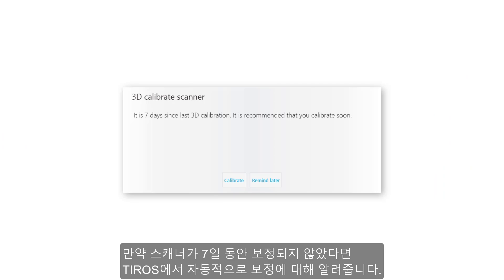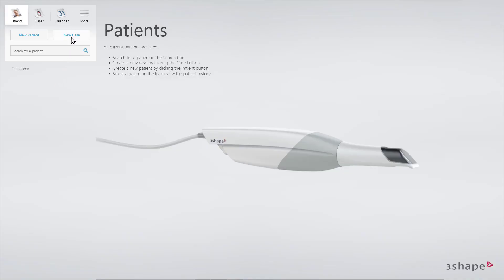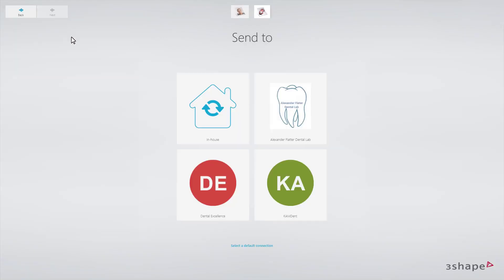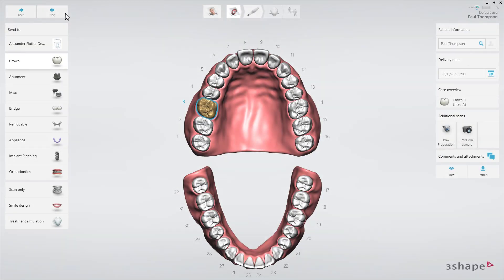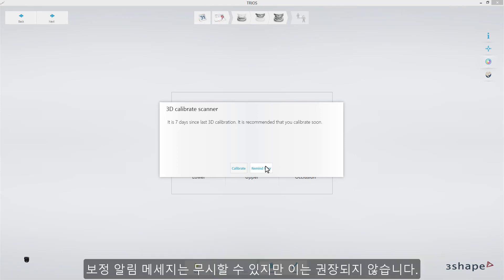If calibration is not done for 7 days, the TRIOS application will automatically remind you about it. A message for a missing calibration type will appear on the screen upon opening a new order. There are two ways of initiating calibration: from this message or in the Settings page. Although it is possible to dismiss it, it is not recommended to ignore these warnings.